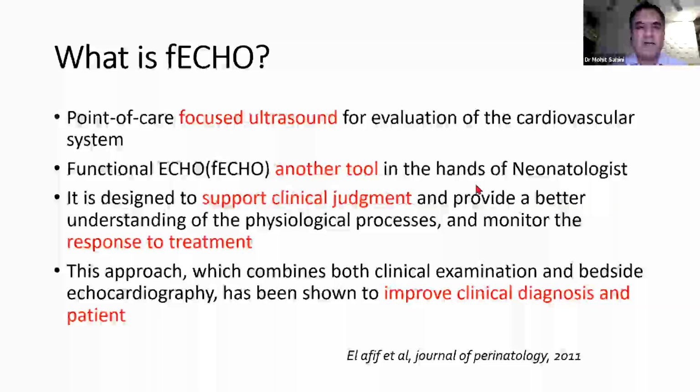So when we talk about the normal views, the normal assessment of various views and indices, that's what we consider a functional focused ultrasound or focus echo. This is there to support your clinical judgment and to improve your clinical diagnosis. All these things we'll be doing in NICU are for a better outcome of the patient, and it helps in augmentation of your clinical judgment.